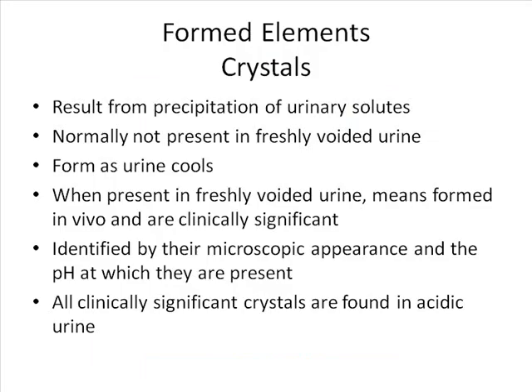Now let's look at the crystals. Excuse me. Now, how are crystals really identified? Number one, look at the pH and the solubility. All right. Number one is the pH. Easiest thing. Glance down at your urinalysis chemical report, look at the pH.